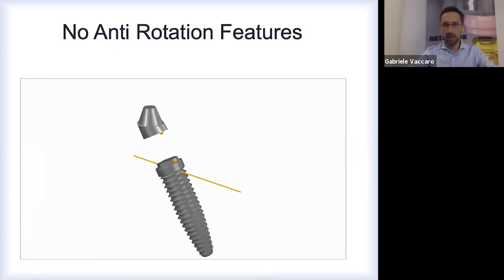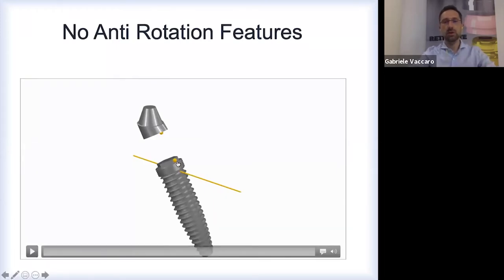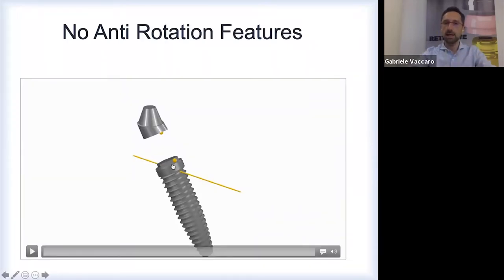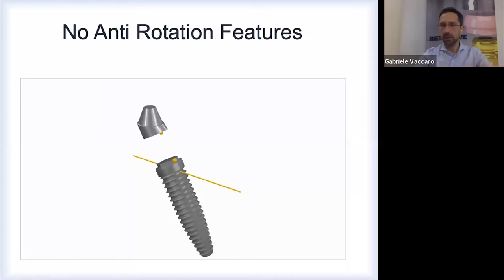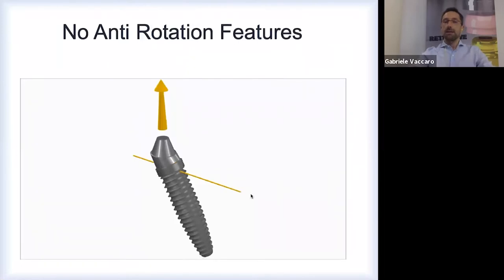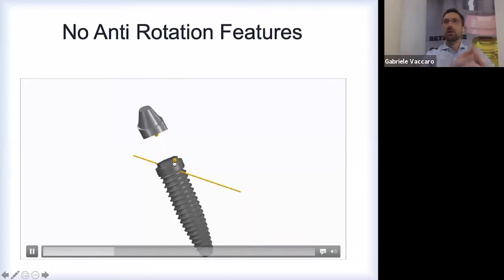Another important argument is the anti-rotation feature, because when we have multiple fixtures and we screw an implant into the bone, we have a reference point that is our hexagon. If we use a device like a multi-unit, a tilted, angulated multi-unit abutment or angulated abutment for a cemented crown, we strongly need this hexagon to be put in the perfect place by the surgeon. But this must be done at the surgical moment.